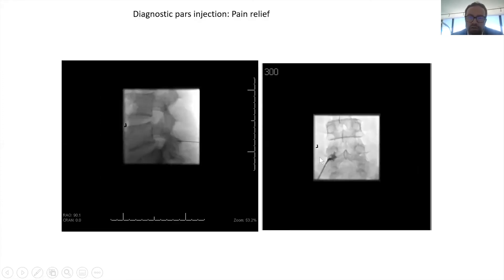This is the injection — they inject next to the pars and use a guide to make sure the material being injected goes to exactly where they want it to go.